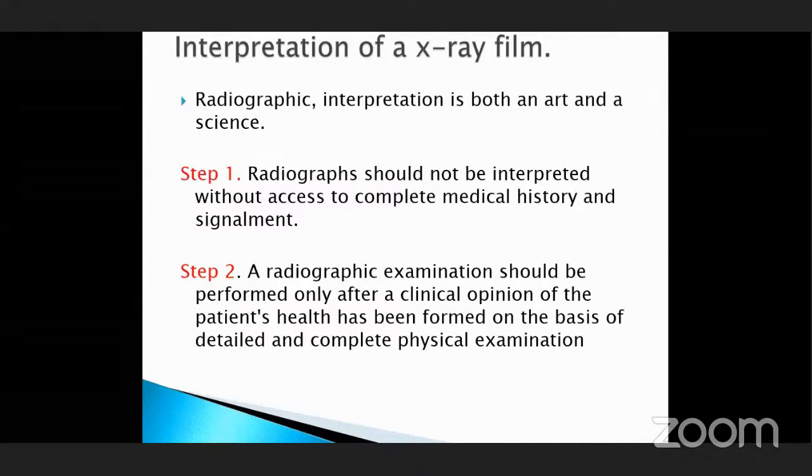Like in very young animals, the abdominal contrast is very poor because of the poor fat content. So you see only black and white densities, the detail is completely lost. You must know that it occurs in young patients. Moreover, when you evaluate the long bones in case of young patients, sometimes you may say it is a fracture because the epiphyseal line is very clear. The metaphysis and epiphysis have a distance. So you must consider the age, weight, breed, and sex of the patient before giving interpretation to a radiograph.